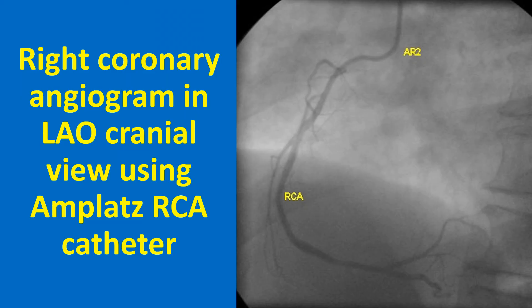An LAO cranial view of right coronary angiogram using an Amplatz right catheter is shown. This RCA was difficult to cannulate with Judkins right catheter even after repeated attempts. The angiogram shows only minimal luminal irregularities of the RCA. Right ventricular branches are seen originating from the proximal region, and terminal branching of the RCA into posterior left ventricular branches and posterior descending coronary artery are also seen.